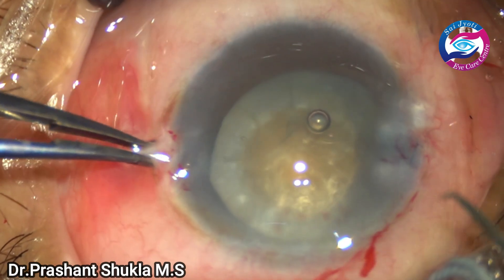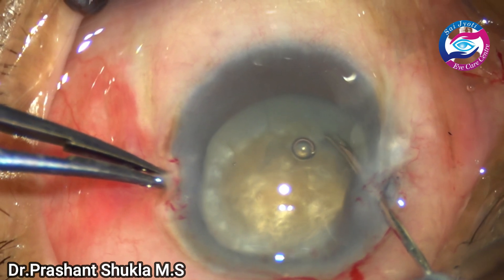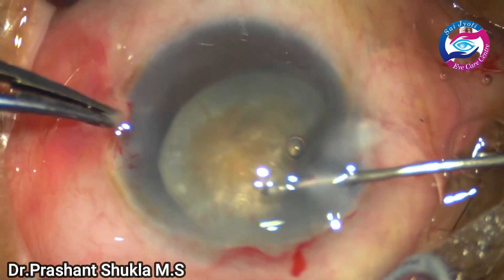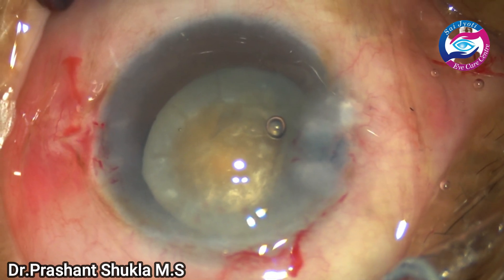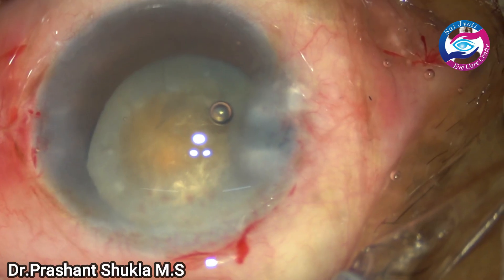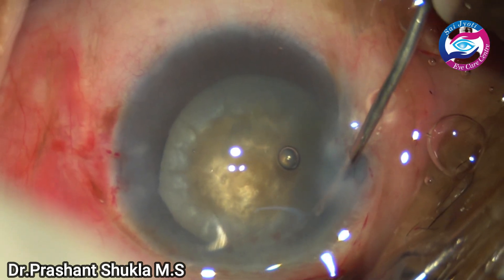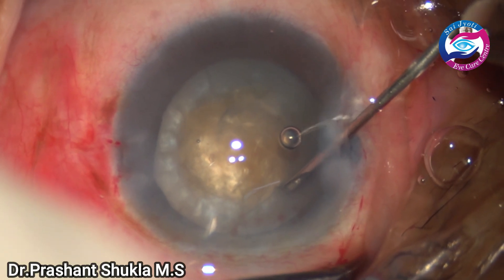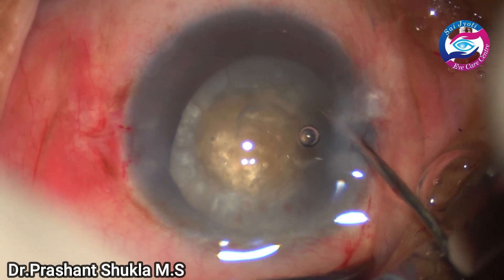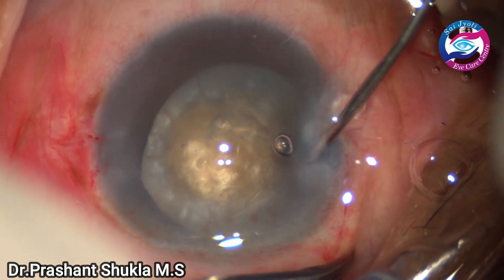The intended size of the capsule rhexis was relatively smaller than what I had wanted, so here I am using a cystotome to give some radial nicks on the anterior capsular margin. The visibility is not very good because the cornea is not very clear, and the nucleus size is big — so I don't want an inadvertent intracapsular extraction. I am giving some radial nicks on the anterior capsular margin — two or three on the right side and a few on the left side — so that we don't have any problem while maneuvering the large bulky nucleus out of the capsular bag.